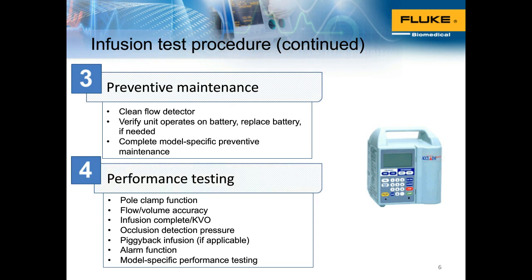If you're just looking for an electrical safety analyzer that tests infusion pumps, a simple device that doesn't have applied part testing would be adequate, or up to 5 applied parts would also be good in order to test an infusion pump for electrical integrity.